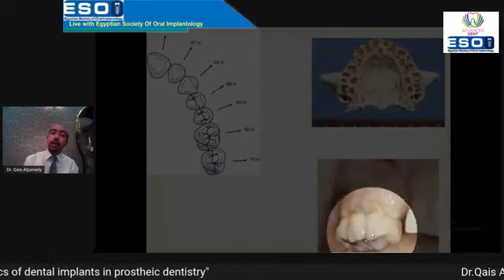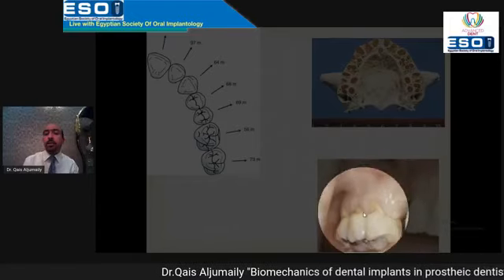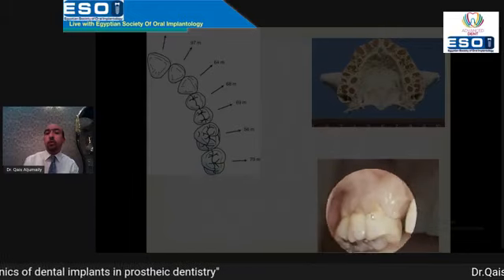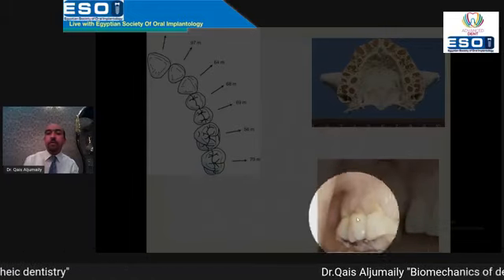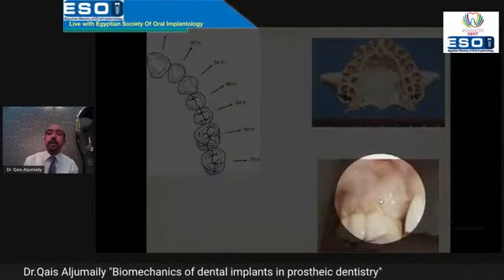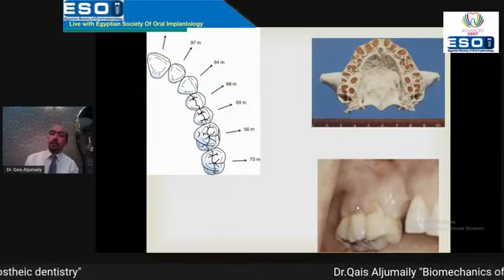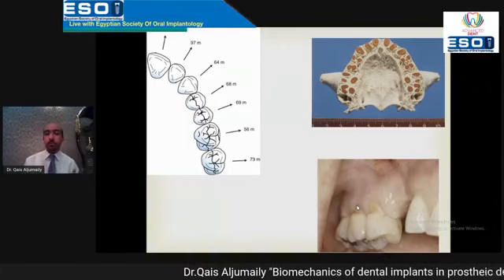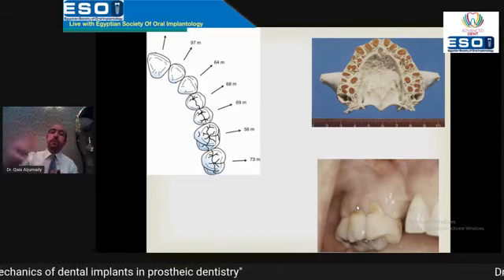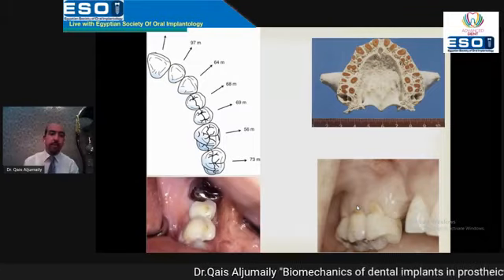أحيانا تحت الضغط العالي والقوة الهائلة من الإطباق بيصير عندي هاي الحالة اللي احنا نسميها abfraction، إنه detachment of the enamel layer in this notch like appearance gingivally. هذا في أحسن الحالات، حتى السن ما ينكسر بيصير عندك هاي الحالة بالناتشورال تيث. بالإمبلانت يا إما راح يصير عندك chipping أو fracture بالبروستيسيس، أو الكارثة إنه الفورس كلها يكون بها ترانسميشن للفيكستشر وبعدين بتروح على البون. هاي مشكلة كبيرة.